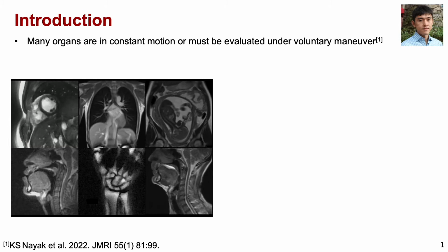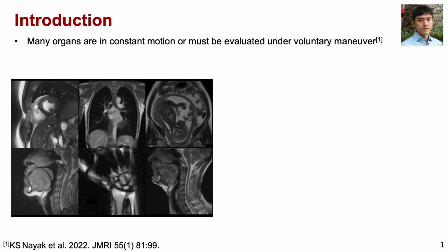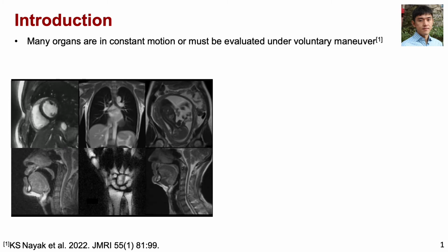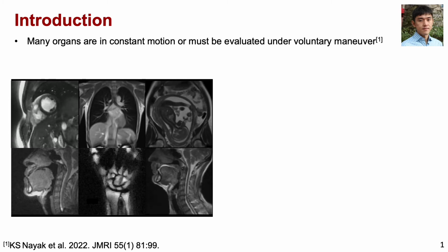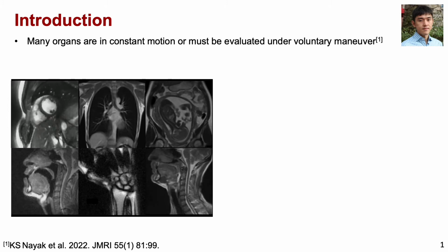A more improved way of scanning such organs is by using real-time imaging techniques. Instead of freezing the motion, we can capture the motion in real time and reconstruct real-time images to evaluate the health conditions in the lung and the heart.